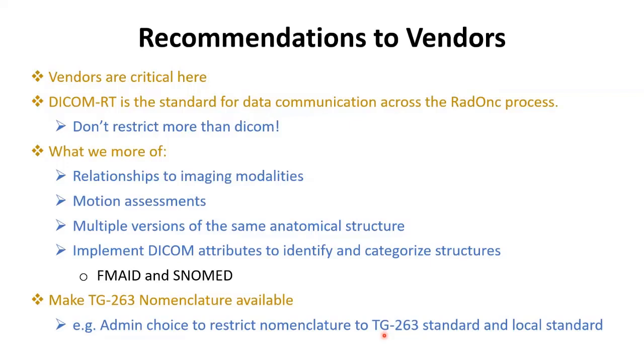Okay. For the first one, that each doctor has their own structures, this is something we faced in our department actually. We told them, whatever structures you need, we'll create them for you. So we created all types of structures that the physician would like to see, let's say in the breast case or in the prostate case, and we made it a template. And we don't give them the privilege to create any more structure sets. Only the admin has control over this. And then we showed them, whatever you would like, we can adopt in the system.